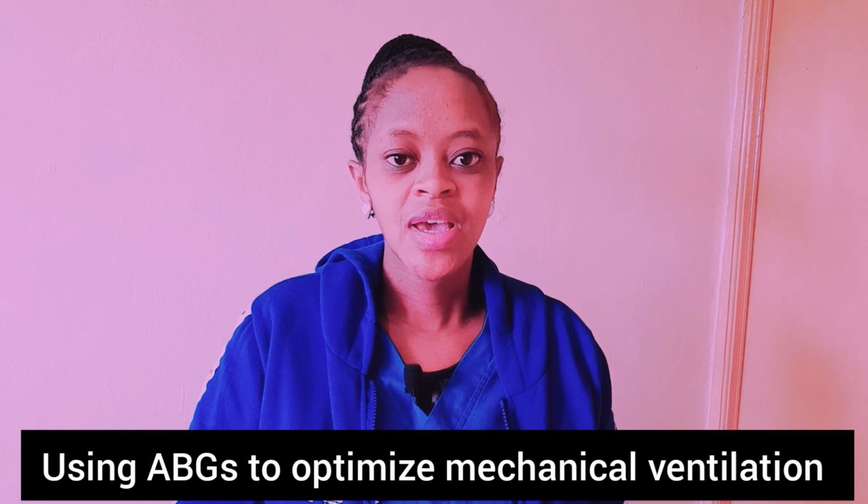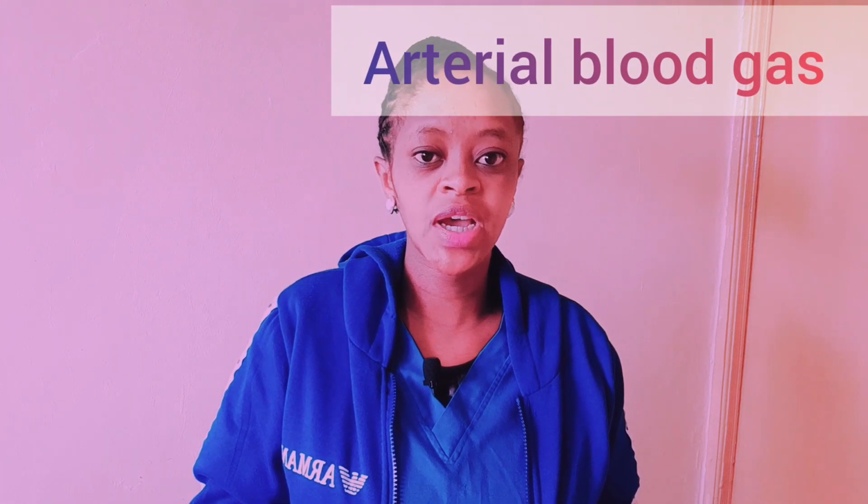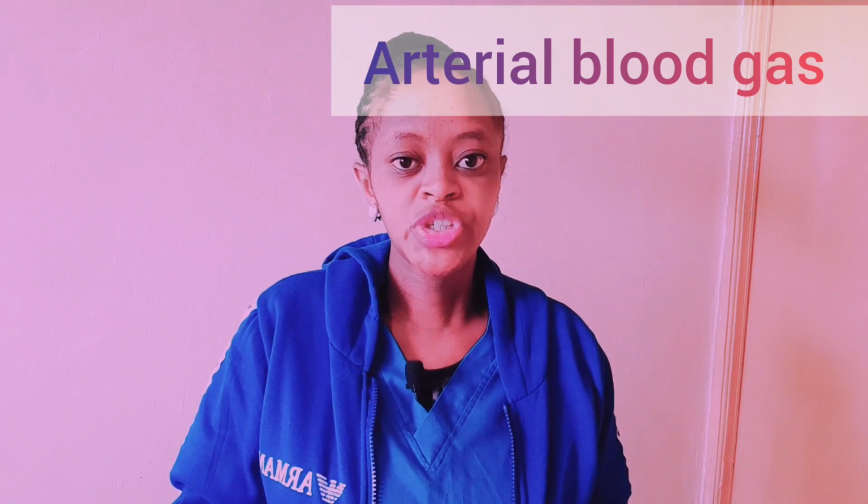Hello everyone, I'm here again to talk about using ABGs to optimize mechanical ventilation. ABGs, that is the arterial blood gas analysis, can tell you about patients' oxygenation through the arterial oxygenation and the oxygen saturations of the patient as seen in the pulse oximeter.